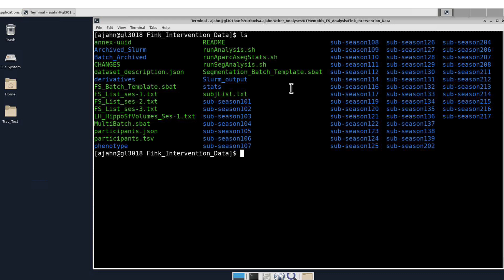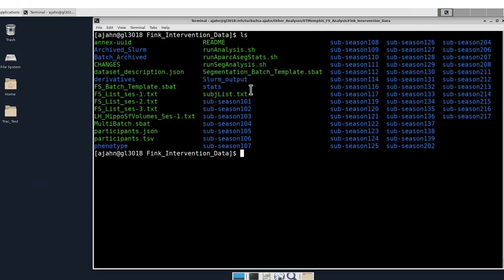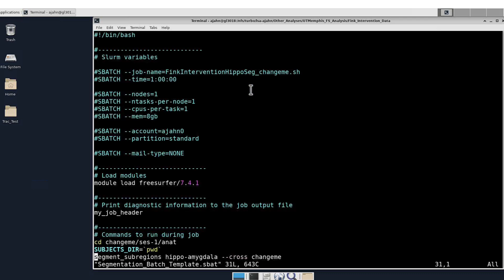In this directory, I've downloaded all of the subjects for this particular dataset, and I have something called segmentation-batch-template.sbat. Within this, I specify parameters like the amount of time for this particular job, the number of nodes, CPUs, and so on.